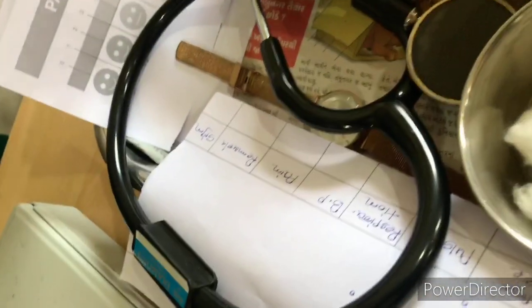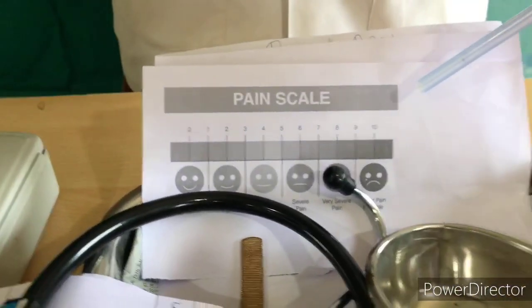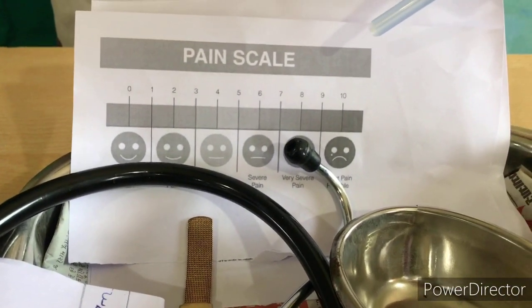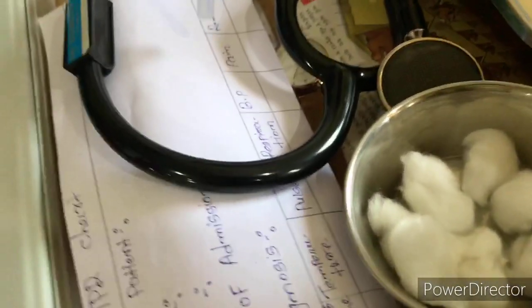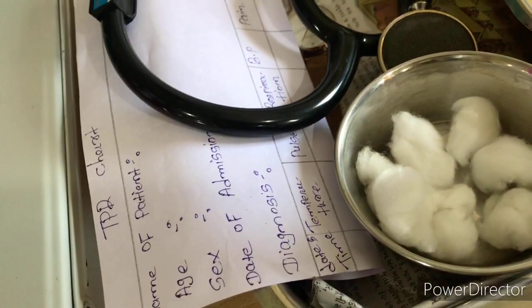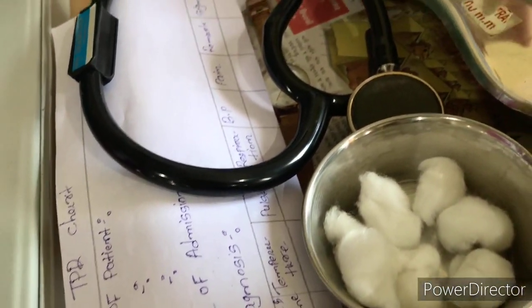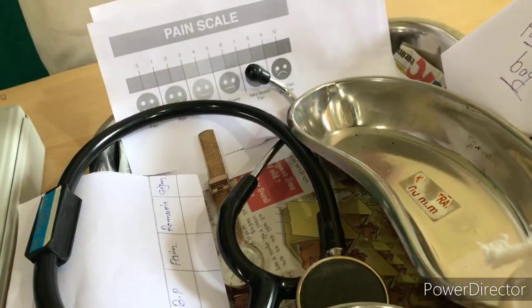Additional articles include: a sphygmomanometer to measure blood pressure; a stethoscope to auscultate the pulse; a pain scale to assess the intensity of pain; a watch; pen and TPR chart to record the findings; and a record and report sheet to record the procedure.